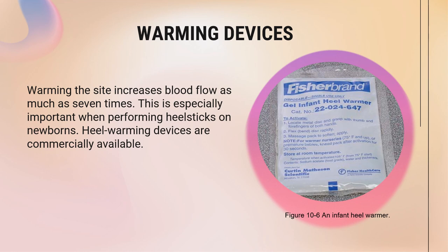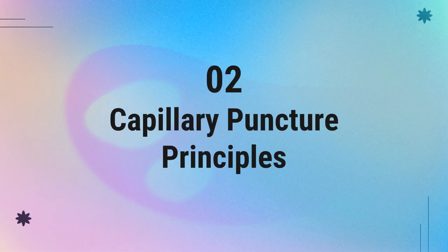But what if, for example, you don't have a warming device? A towel or diaper dampened with warm tap water can also be used to wrap the hand or the foot before skin puncture. However, you have to take note of how hot the water is to avoid scalding the patient. So we're done with the capillary puncture equipment. Now we move on to the principles.